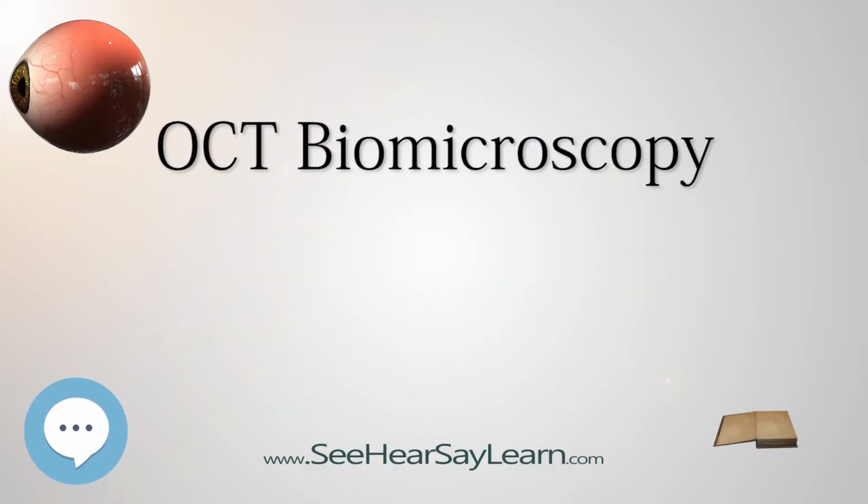OCT biomicroscopy is the use of optical coherence tomography, OCT, in place of slit-lamp biomicroscopy to examine the transparent axial tissues of the eye. Traditionally, ophthalmic biomicroscopy has been completed with a slit-lamp biomicroscope that uses slit beam illumination and an optical microscope to enable stereoscopic, magnified, cross-sectional views of transparent tissues in the eye, with or without the aid of an additional lens. Like slit-lamp biomicroscopy, OCT does not penetrate opaque tissues well but enables detailed, cross-sectional views of transparent tissues, often with greater detail than is possible with a slit lamp.